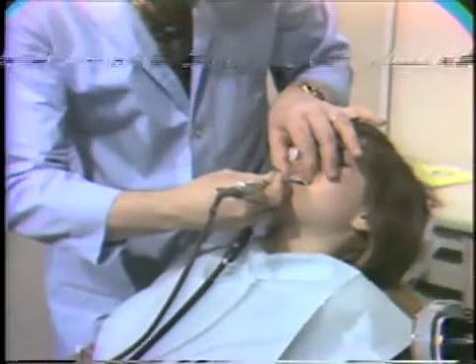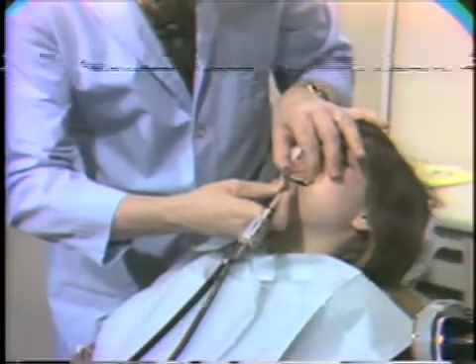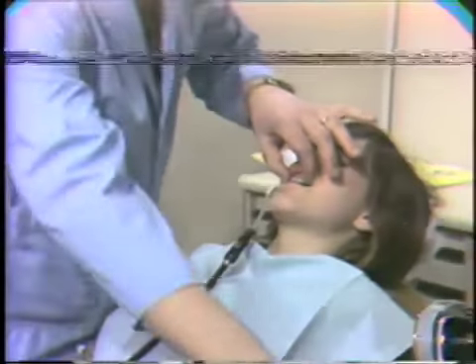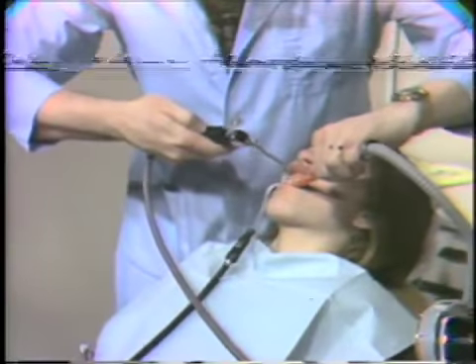This will allow our agents to get at the enamel a little bit better. Now Carolyn here keeps her teeth nice and clean all the time, so she doesn't have too much here for us to clean away. Okay, just a very simple prophylaxis, and that's all that's needed. Now let's wash away all the toothpaste here.